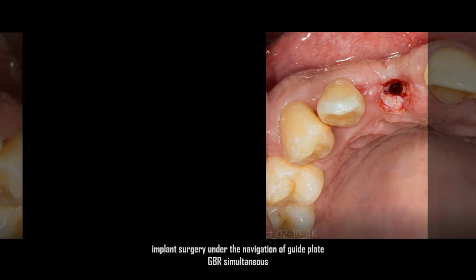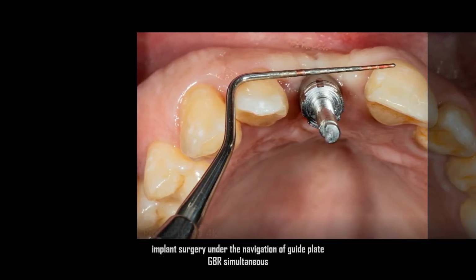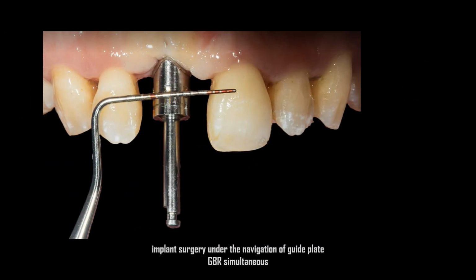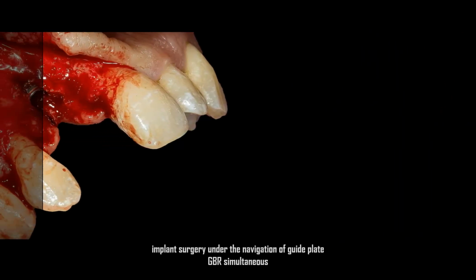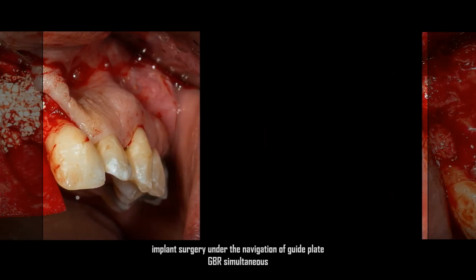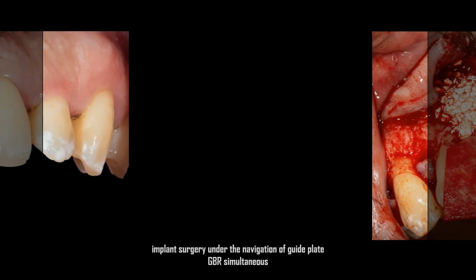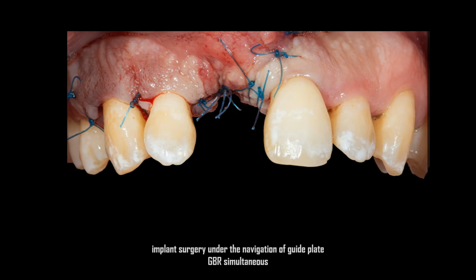Under the precise guidance of the implant guide plate, Dr. Abdel Rahman Karaf and Dr. Kyrilos Henley completed the implant surgery according to the established plan, and the implant placement position was exactly as expected. In addition, due to the insufficient bone volume around the implant, the doctors performed bone augmentation surgery on the labial bone plate simultaneously to ensure the long-term stability of the implant and the aesthetic effect of the post-implant restoration.